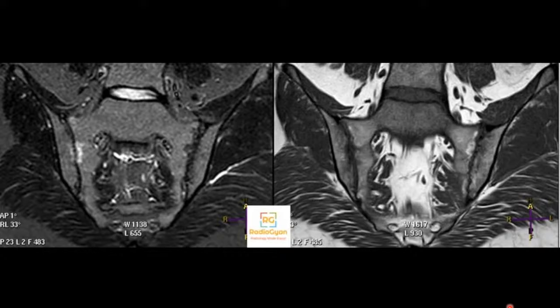So again, I'm getting partial right answers, and I don't want to point out your mistakes, but even when you're reporting in your daily reporting, your impression should sum up everything you see in the case. So if you get into the practice of complete diagnosis, it will really help you improve your impressions. I've seen people report where the body of the report and the impression are similar. You mention everything in the body and the same thing in the impression, which is not really ideal. Your impression should be crisp and short. So let's see if anybody gets it.